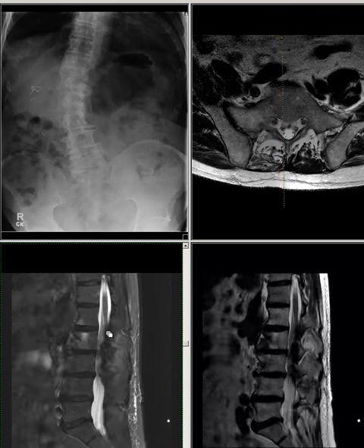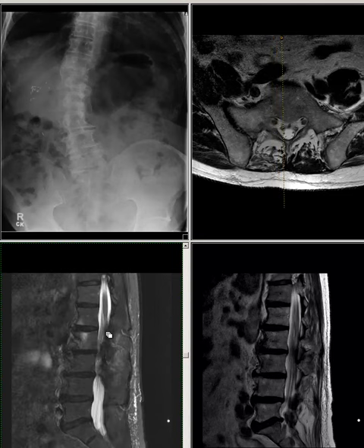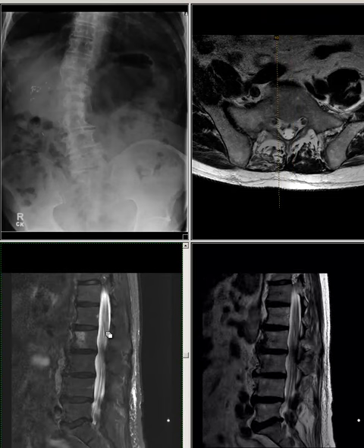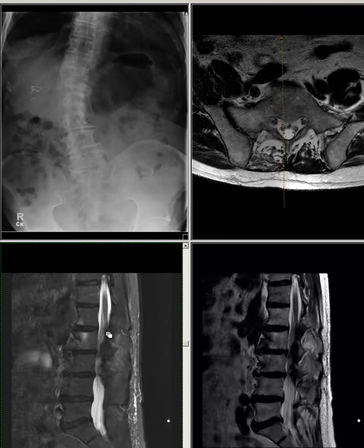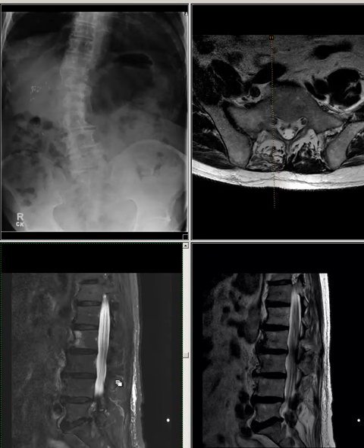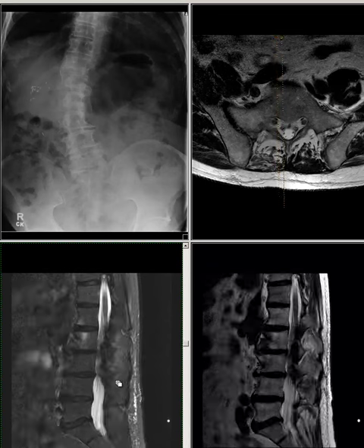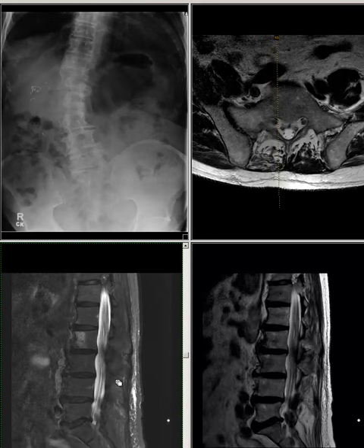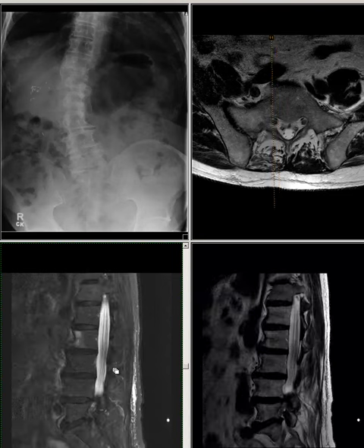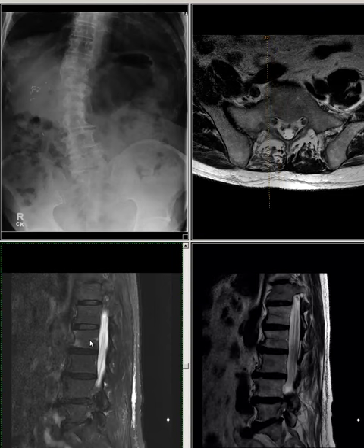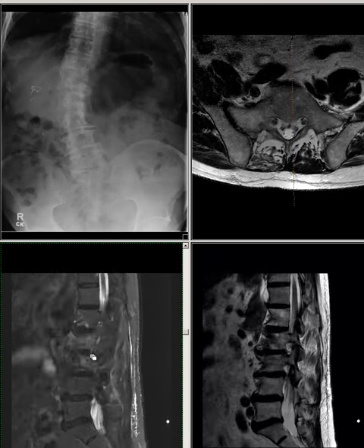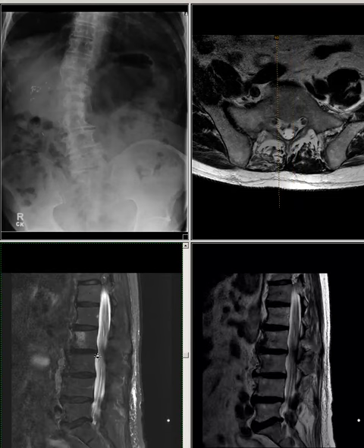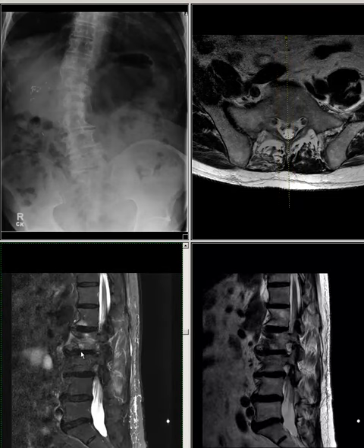The conus medullaris terminates at L1-L2 level with normal morphology and signal intensity. In alignment, 2 mm retrolisthesis of L2 on L3 is noted. There are Modic type 1 endplate changes at L1-L2 and L2-L3 levels, more prominent on the left side.